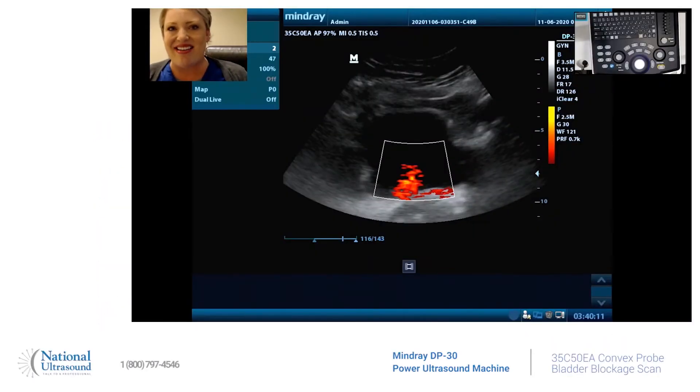Hey guys, this is Holly. I'm a registered cardiovascular and general sonographer since 2008. I am here at National Ultrasound using the Mindray DP30, a portable laptop ultrasound, and I have the curvilinear probe and a linear probe.